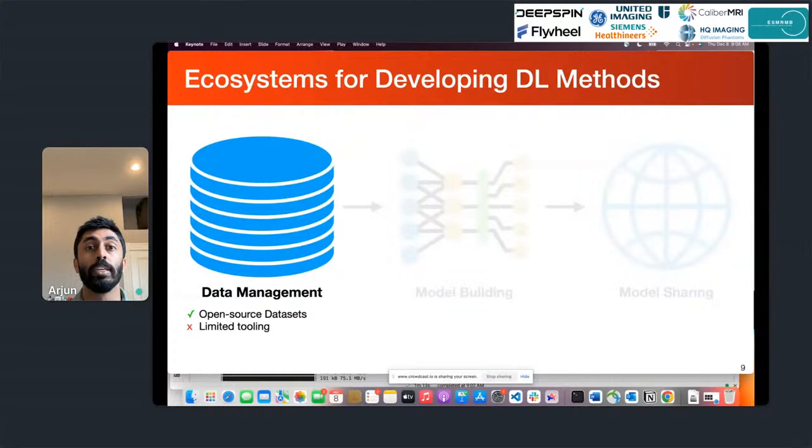So there's been a lot of work in developing good file formats like the ISMRMRD. There's a lot of tools for ingesting that kind of data. But when we're thinking about deep learning, there's a lot of work that needs to go into the infrastructure of optimization so we're not bottlenecked by how we interact with our data.